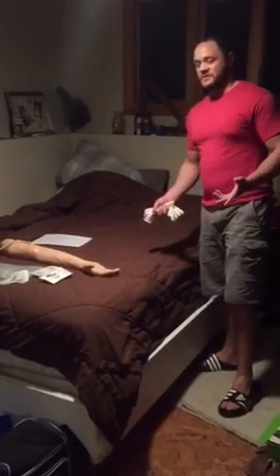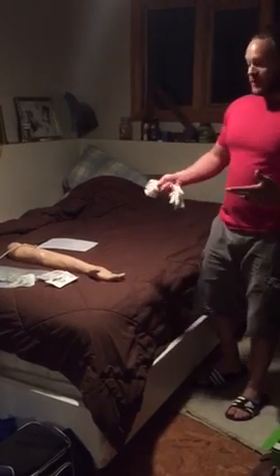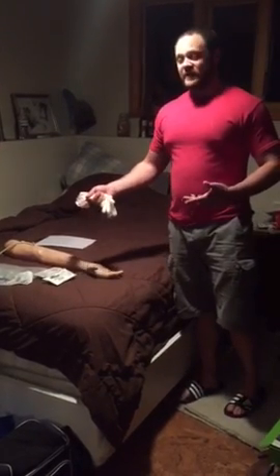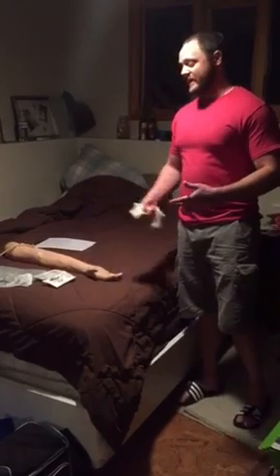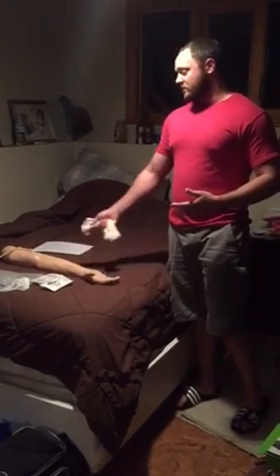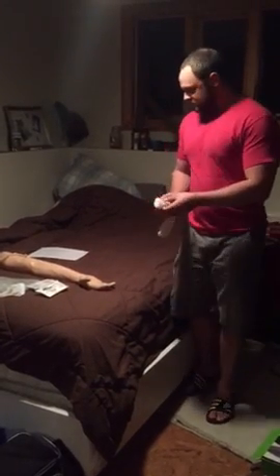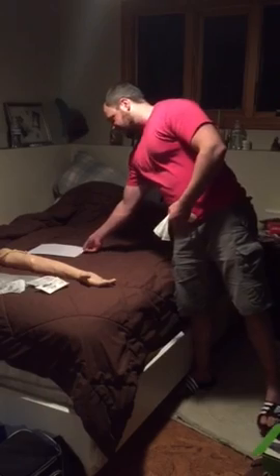Since this is a demonstration, I'm not actually going to waste any of this fluid, so I'm going to verbalize that I'm going to spike the bag and drain it, but I'm not actually going to connect it to the IV and run fluid through a borrowed arm. So, let's finally get this stick done.